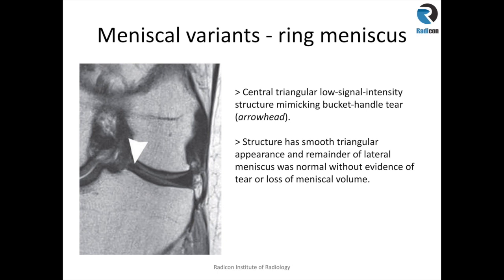However, the difference is that the original volume of the meniscus remains and has sharp contours with no blunting or truncation, and there is no volume loss of the main body, posterior horn, or anterior horn of the meniscus. That indicates this low signal intensity small area in the midline or close to the tibial spines is just a variant called ring meniscus. The incidence is very low, probably less than 0.5%.